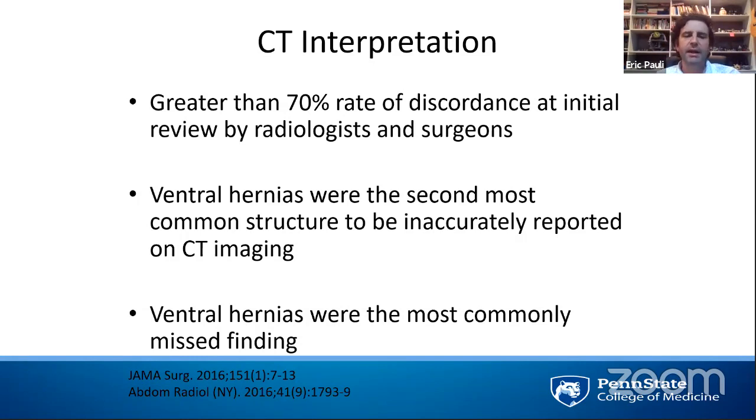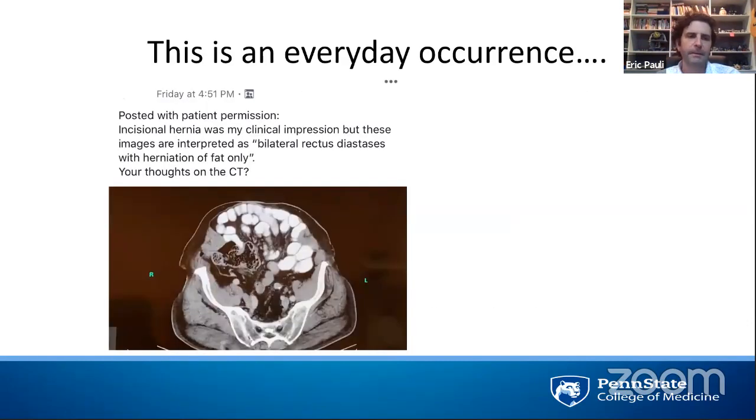And I think this is an important thing that Ryan mentioned when he's scrolling through a scan, especially on a person who's had an incisional hernia. Yeah, there might be a hernia you can feel, and that might be reported on the CT scan, but are there smaller hernias up top, right? Am I actually doing a much bigger repair here than I think? I want to know that ahead of time, not when I'm in the operating room doing a preperitoneal dissection and wondering, have I actually gotten to the top of where this hernia is, or am I actually leaving hernias behind?